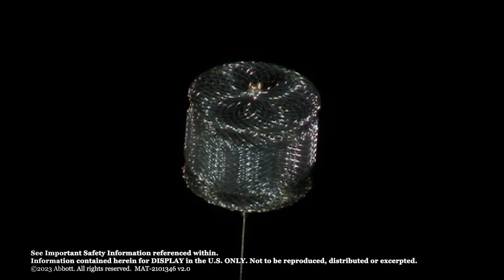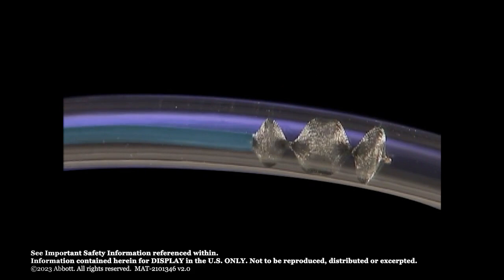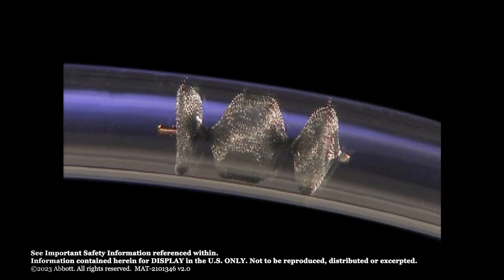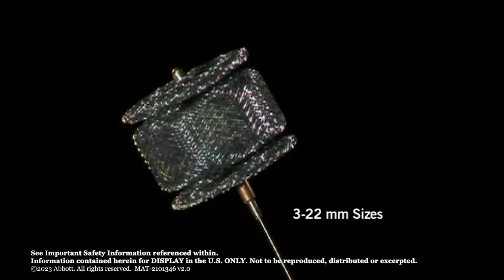The Amplatzer Vascular Plug 2 is designed with a central lobe and distal and proximal discs. The three zones of apposition and retention provide secure positioning and are intended to provide full cross-sectional vessel coverage of occlusive material with a single device. The Amplatzer Vascular Plug 2's unique design also creates six planes of occlusion. Each successive lobe of occlusive material serves to create an additional plane that acts as a barrier and leads to thrombosis formation and occlusion.